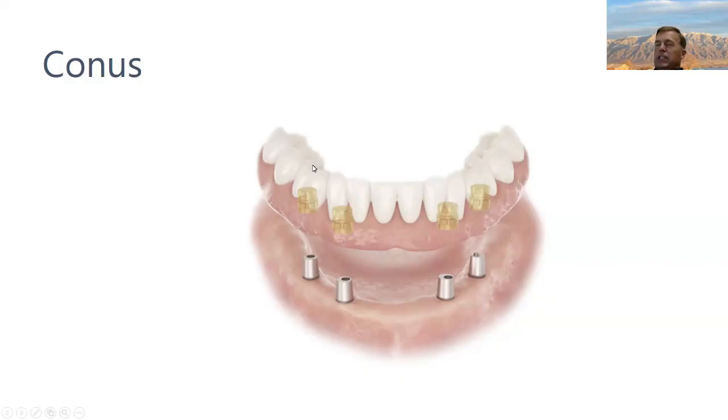The main thing is, for your patients, they have to take this out at least once a day. It can get cold welded. You can get a crown popper to get it off, so it doesn't stay welded and won't come apart. With this, there is a digital workflow, but it's very different than what we talked about. So again, if you want to find out more, let me know.